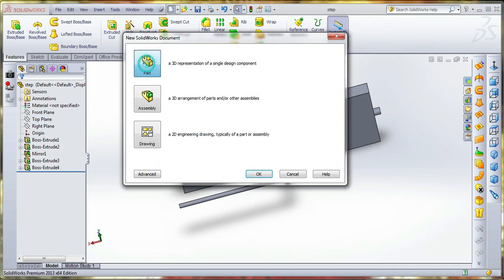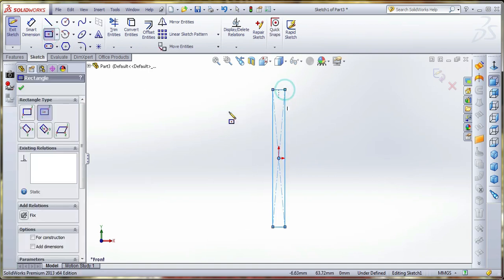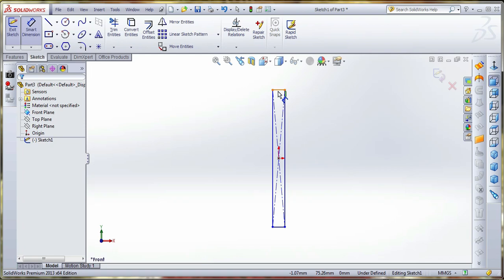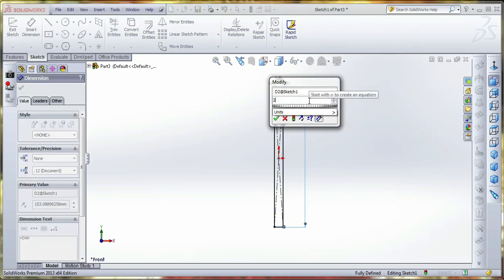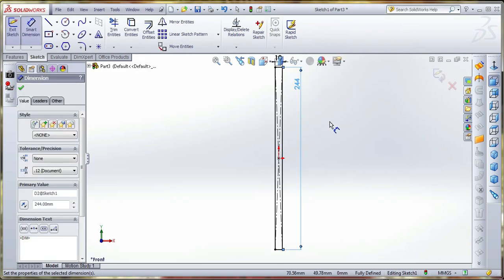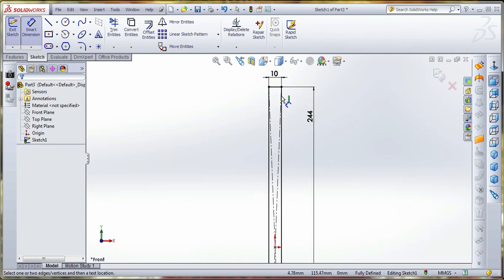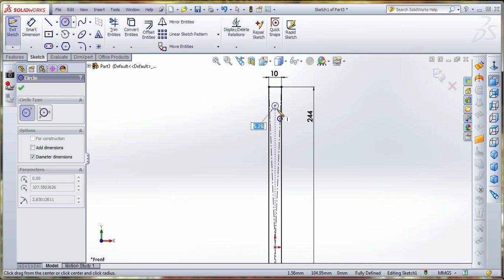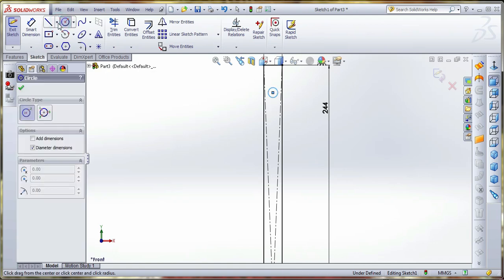We will draw the next part. Sketch and select the datum plane. Draw the support. The thickness is 10. Total length is 244. You can zoom in and zoom out by scrolling the mouse center ball. Each step's mechanism is locating on these supports.